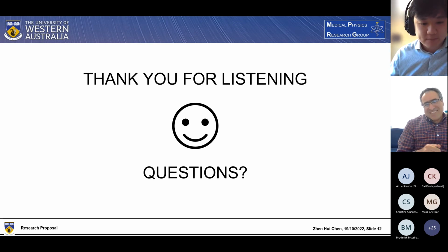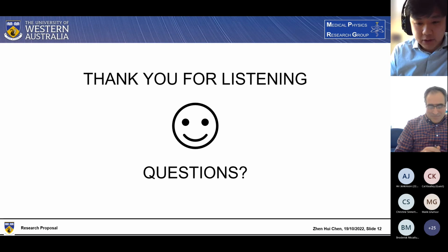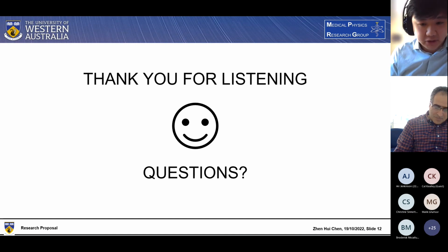Quick question for you, Zhen. Thanks for the talk. With your predictive model, is there an underlying assumption there that the radiation isocenter is stable over time? Yes. So according to TG-198, it's assumed that once the radiation isocenter has been determined for a particular LINAC during commissioning, it should stay stable for the life of the LINAC. And that would be an underlying assumption.